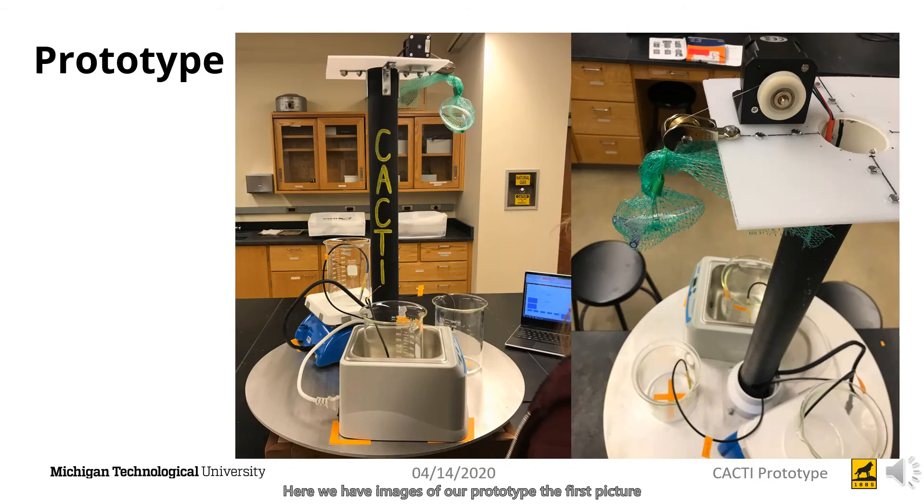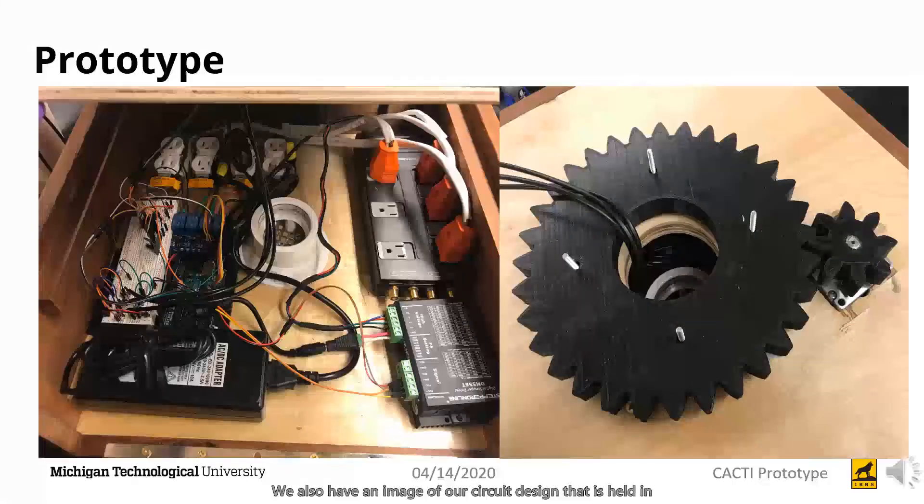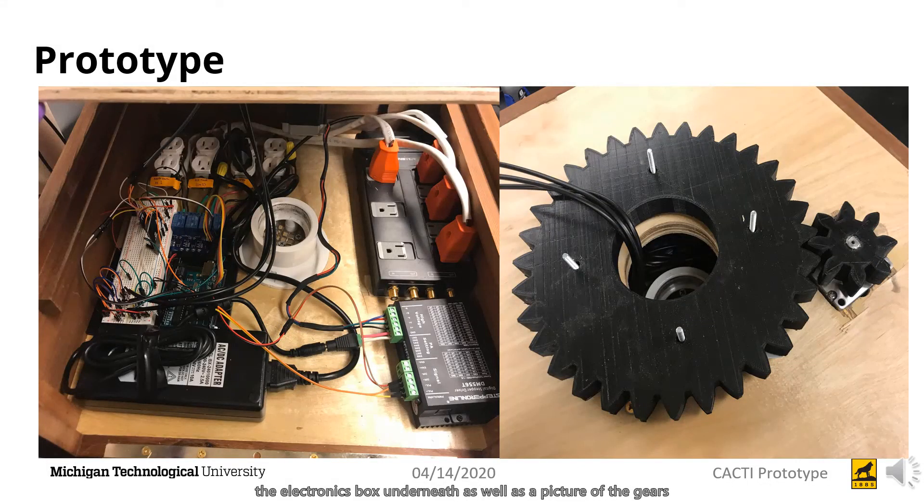Here we have images of our prototype. The first picture is a front view where you can see the components sitting on top of the plate, as well as an overhead view showing where the sample is dropped from and the containing unit, which is an inert netting. We also have an image of our circuit design held in the electronics box underneath, as well as a picture of the gears that we printed ourselves out of polylactic acid filament used for fast prototyping development.